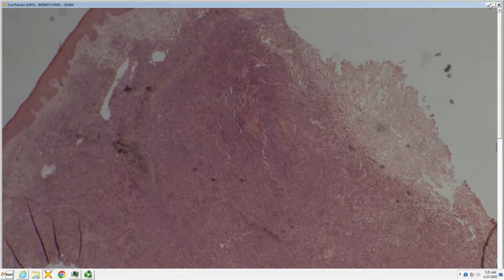An immunoblast, the nucleolus is central. Centroblast, it's peripheral. Immunoblast is a little more poorly differentiated still than a centroblast. So as you go better differentiated, it's immunoblast, centroblast, centrocyte. Centrocyte has the peripheral nucleolus and a cleaved nucleus.